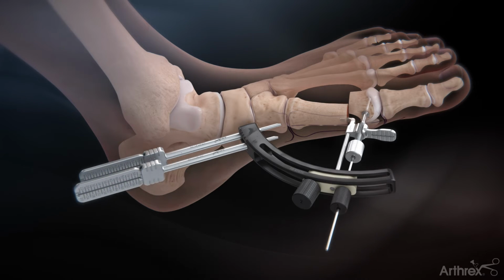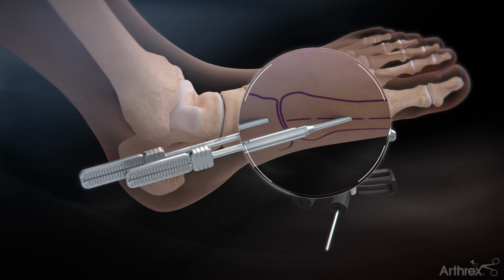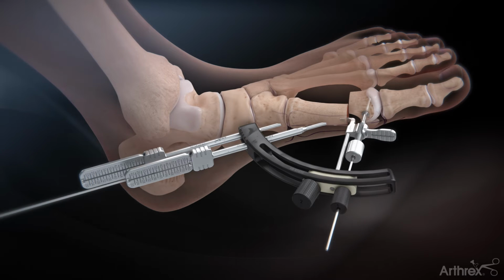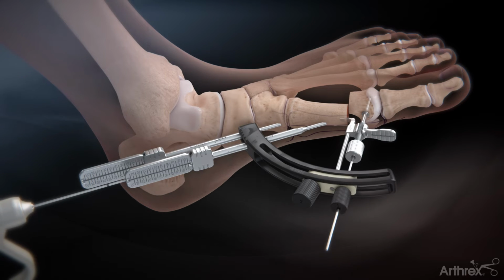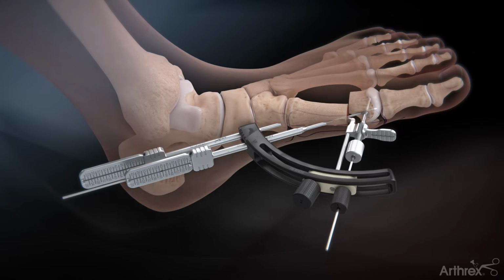Insert a second K-wire sleeve into the most distal slot of the guide, ensuring contact at the drawn midline of the metatarsal. Advance a K-wire through the sleeve and confirm bone purchase. This K-wire serves as temporary proximal fixation to align the guide to the metatarsal.